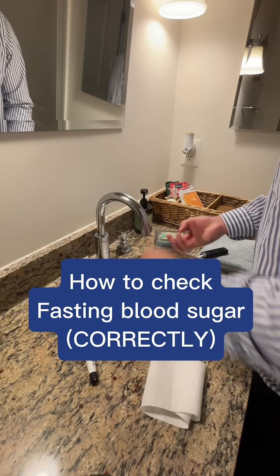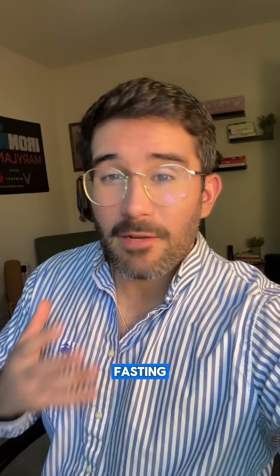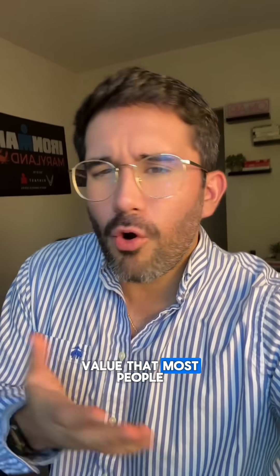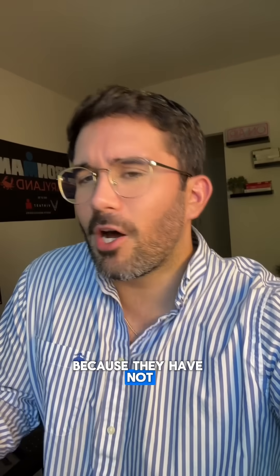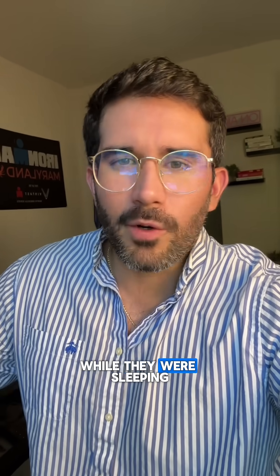Today, I'm going to show you how to test your fasting blood sugar correctly so you can get accurate results. Fasting blood sugar is the value that most people check when they wake up because they have not eaten anything during the last 8 to 10 hours while they were sleeping.